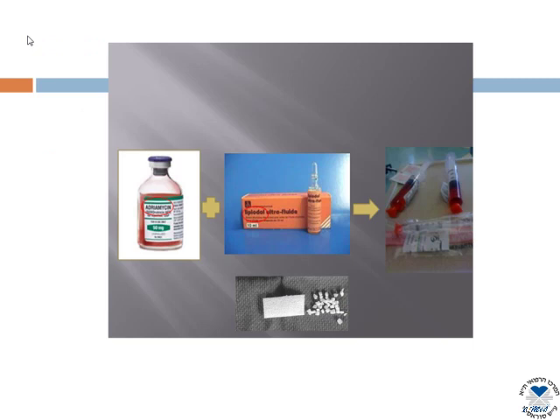In a nutshell, what is TACE? We are delivering a mixture of different agents transarterially via catheters into the hepatic artery. Usually, what is called classic TACE is adriamycin, which comes in powder, is dissolved in contrast material, and then suspended in lipiodol. And then you get the nice red color on the syringes, which everybody is really enthusiastic to see for the first time. This is the mixture of both drugs.